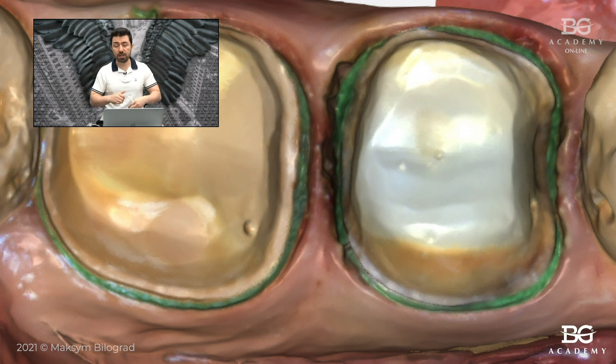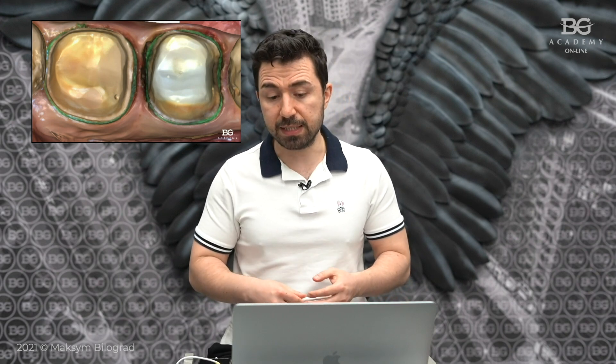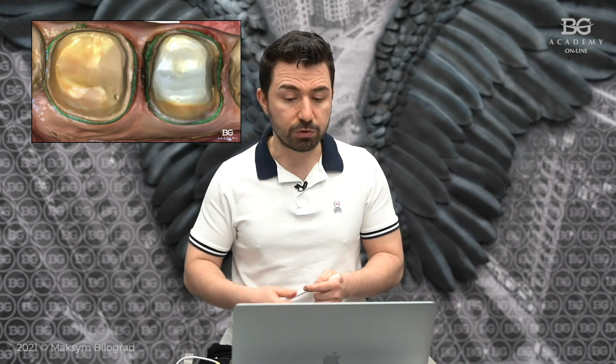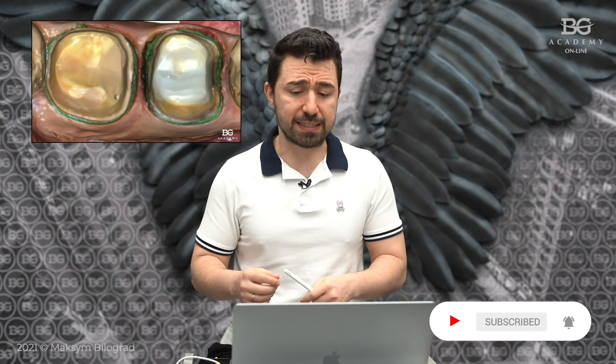We went to the sound tooth structure with our preparation. It was very difficult to prep the distal and mesial aspects of this defect without a mirror — I don't know how you can see that deep distal defect, especially the distal lingual margin, without one. During our online masterclass on crown preparation for posterior teeth, I will show practical tips on how to handle your mirror and burr simultaneously in posterior teeth. So: red burr, electric motor, we went down, then I took electrosurgery. I made electrosurgery to expose these margins because there was some gum around my finish lines and some bleeding, and then I placed the retraction cord.